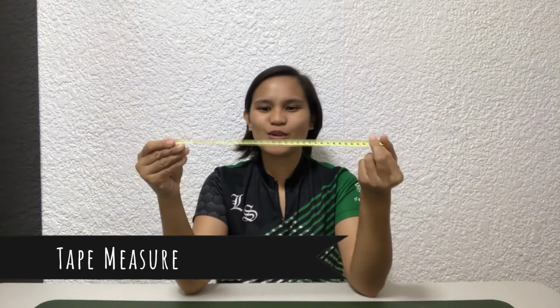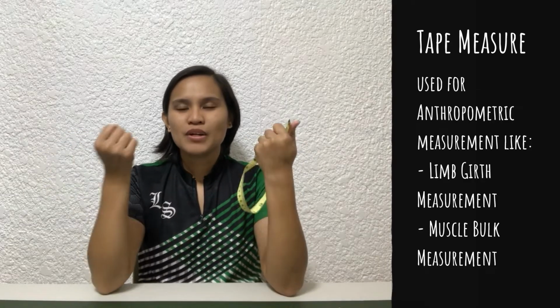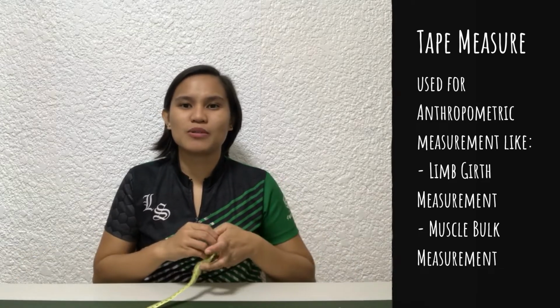We have the tape measure, okay? So, this is just a regular tape measure. Now, the question is, where do we use the tape measure? We use it to assess the limb girth of a patient or the muscle bulk of the patient. Now, when does this happen? It depends on the injury or the problem or the condition of the patient. So limb girth measurement is usually done if the patient has increased fluid accumulation in the body. So it's sometimes noticeable on the distal aspects of the fingers and of the feet.